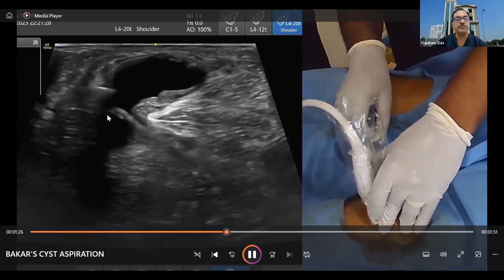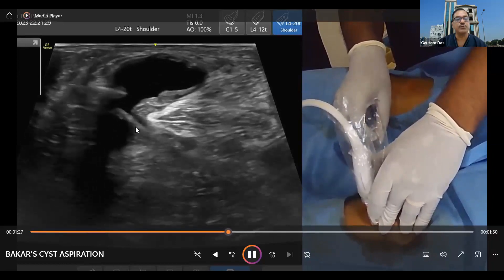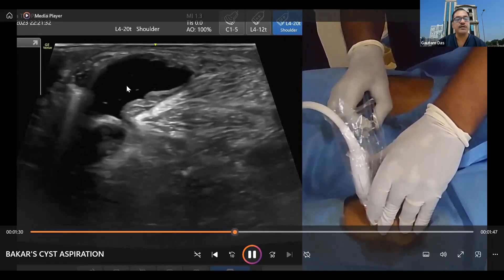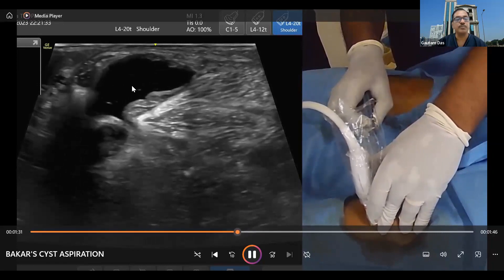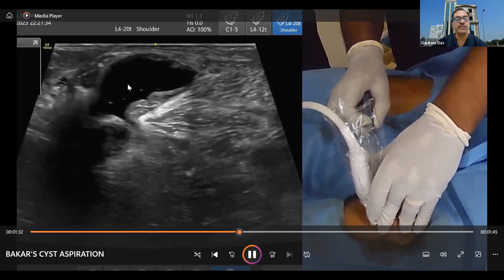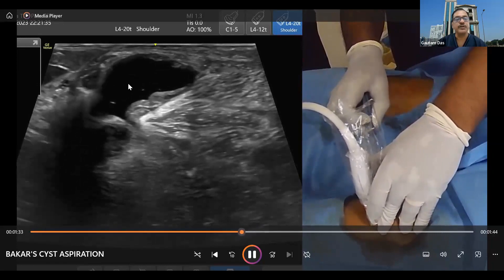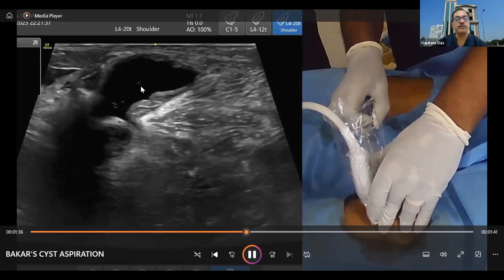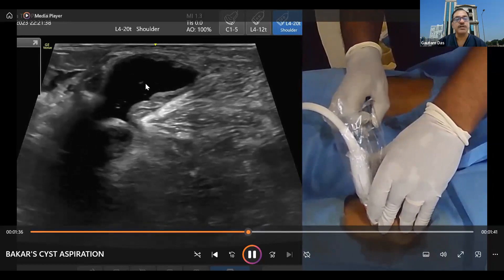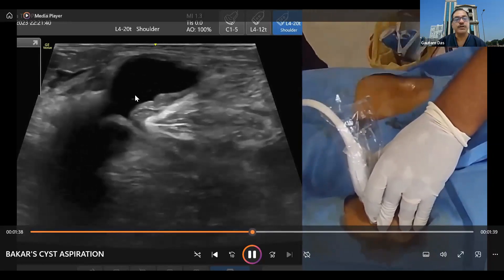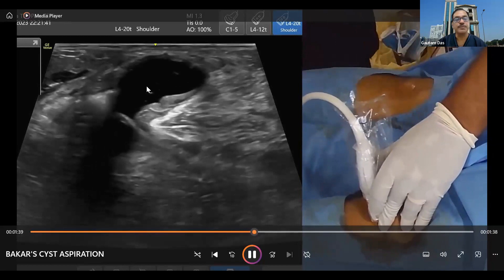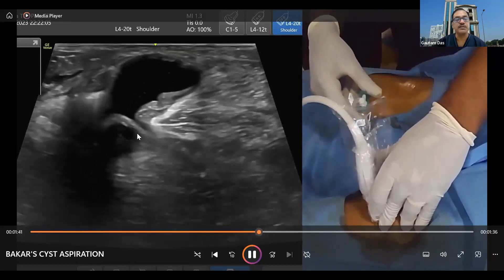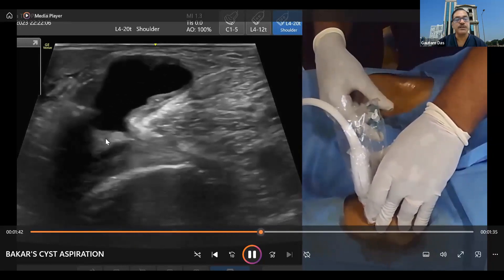There is a septa here. Many times you will be seeing this kind of septa, and if you have septa within the cyst pocket and you are aspirating, you may not be able to aspirate it fully. Sometimes we need to address the different septa. This is a clear septa.